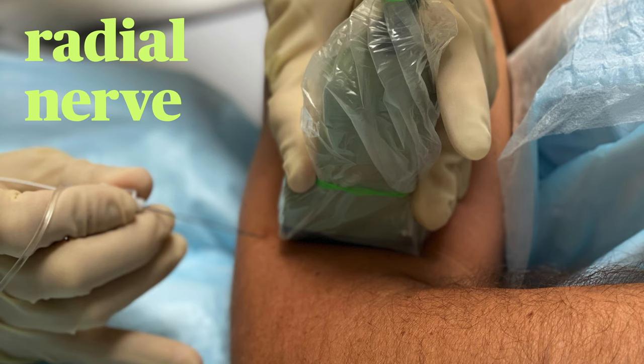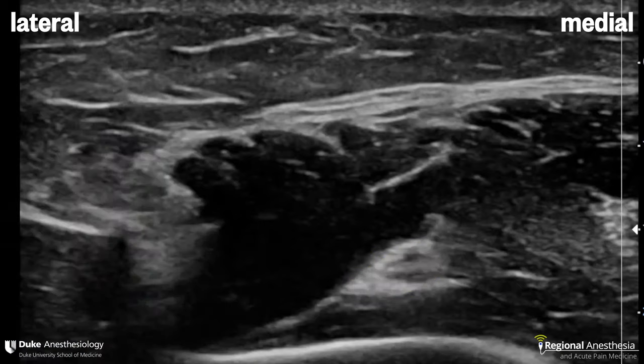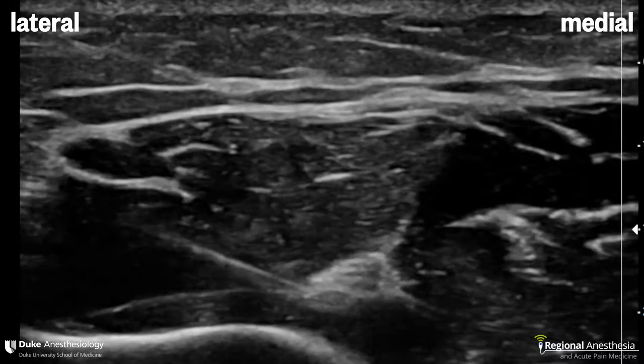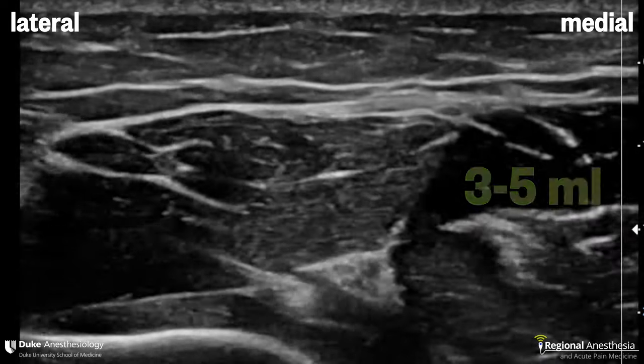There are different ways to block the radial nerve, but we prefer approaching it just above the elbow crease in order to anesthetize both the superficial and deep branches of the radial. With the patient's elbow flexed to 90 degrees and the hand resting on their abdomen, the probe is placed two to three centimeters above the elbow crease. You'll be able to see the hyperechoic radial nerve close to the humerus in the fascial plane between the brachialis and brachioradialis muscles. We bring a needle in from the lateral side, enter the fascial plane where the nerve resides, and administer three to five mils of local anesthetic before withdrawing the needle.